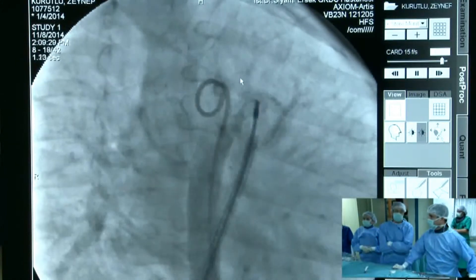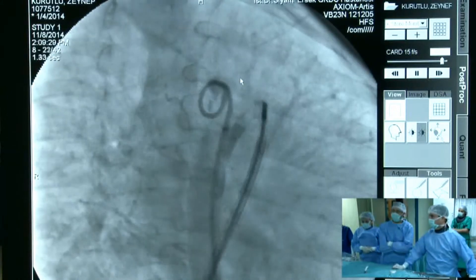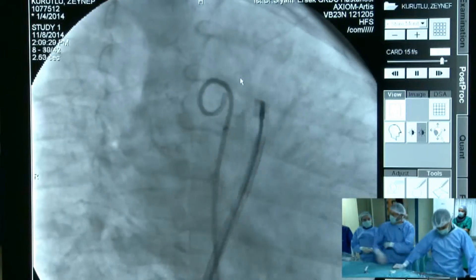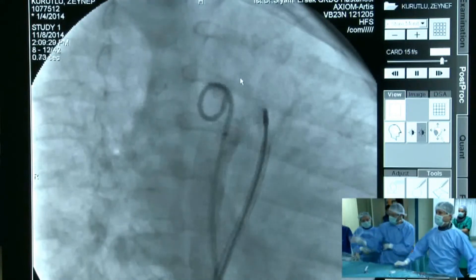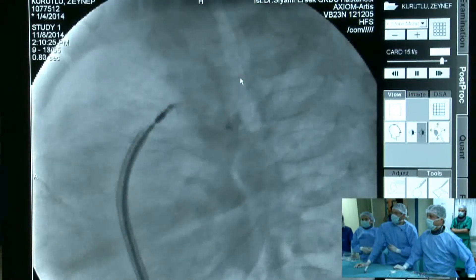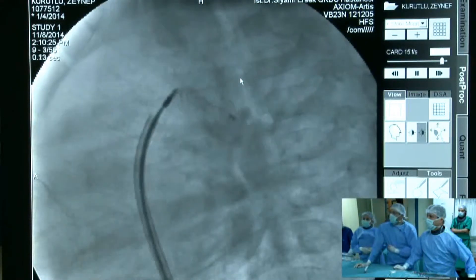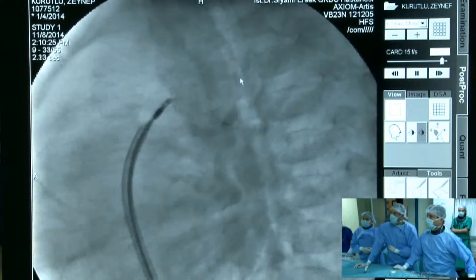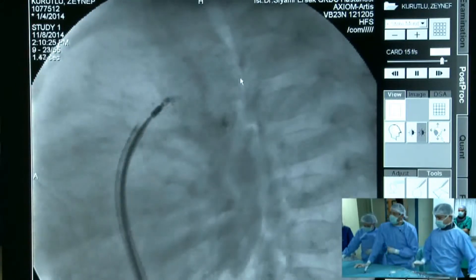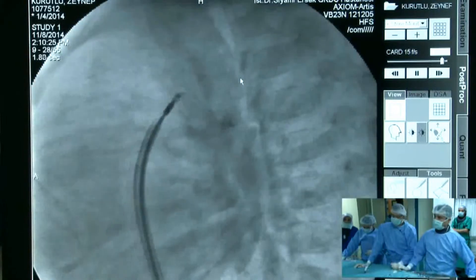That is perfectly demonstrated. We see the ADO1 in place with a contrast injection showing a slight residual shunt before deployment, but we have not yet done the final control injection.